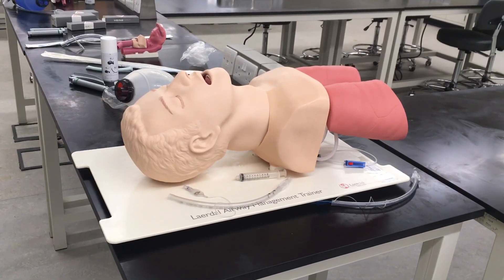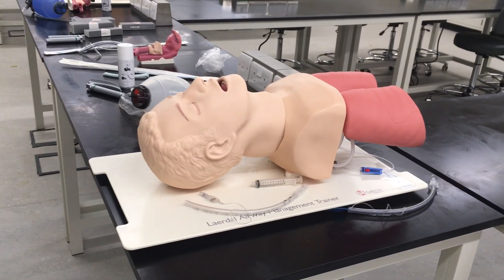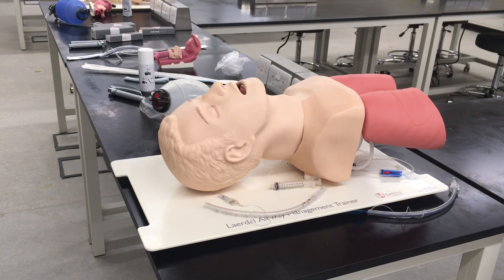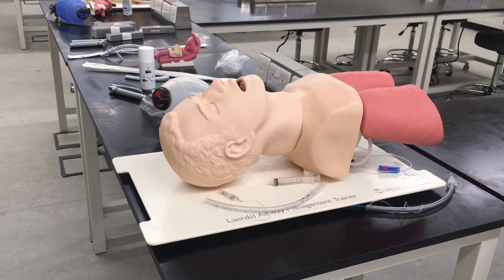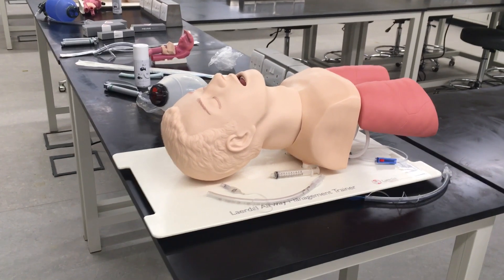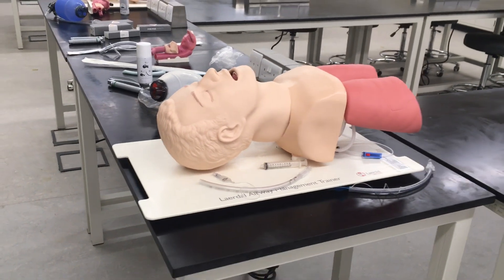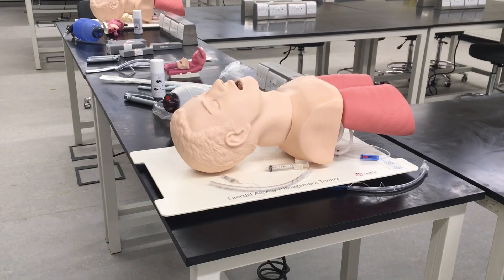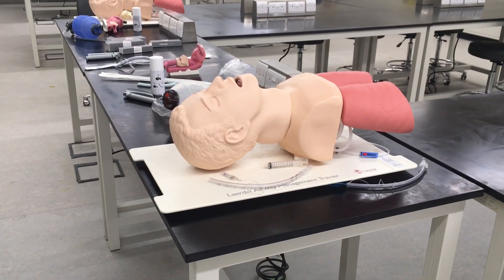This is an overview of the intubation procedure. After you introduce yourself and explain the procedure, you gain the patient's consent.